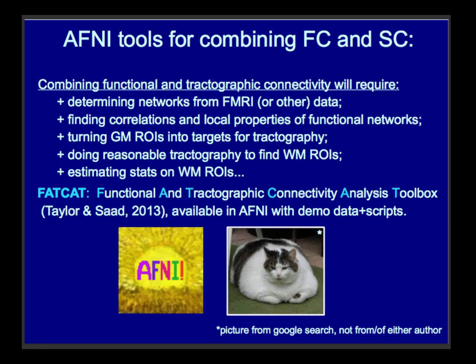So the set of tools in AFNI for doing this is called FATCAT. So it's Functional and Tractographic Connectivity Analysis Toolbox. I mostly put this here just because it's a fun acronym. And who doesn't like pictures of cats from the internet?